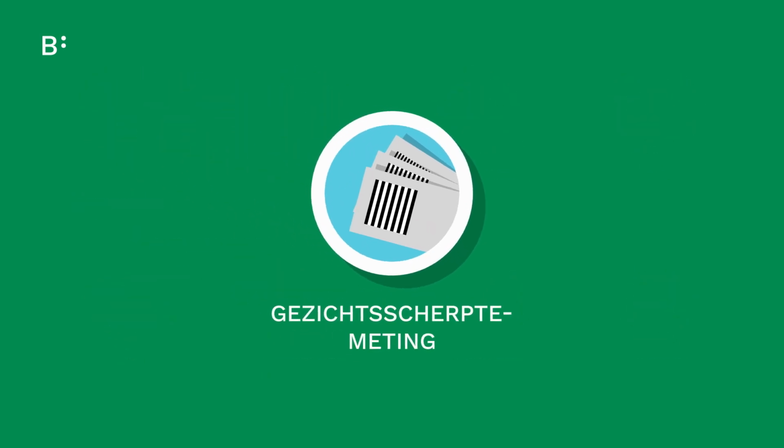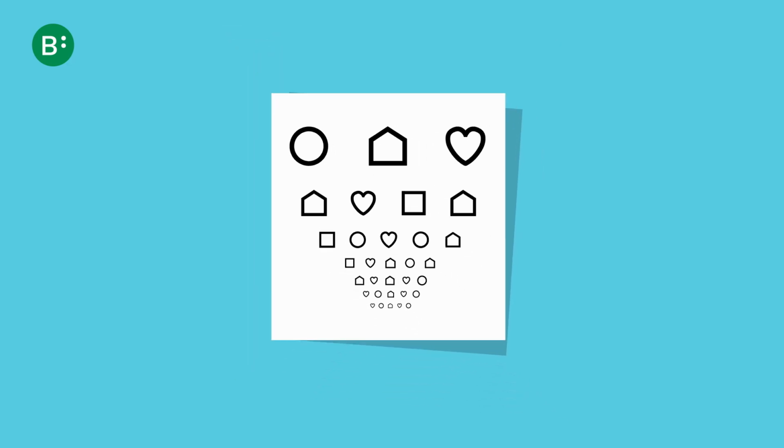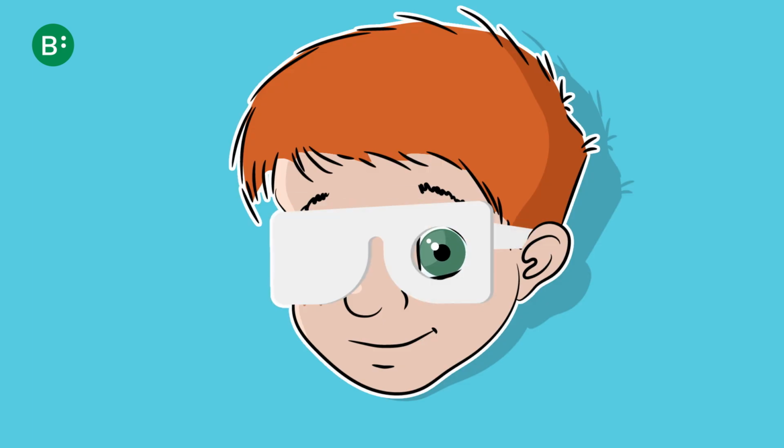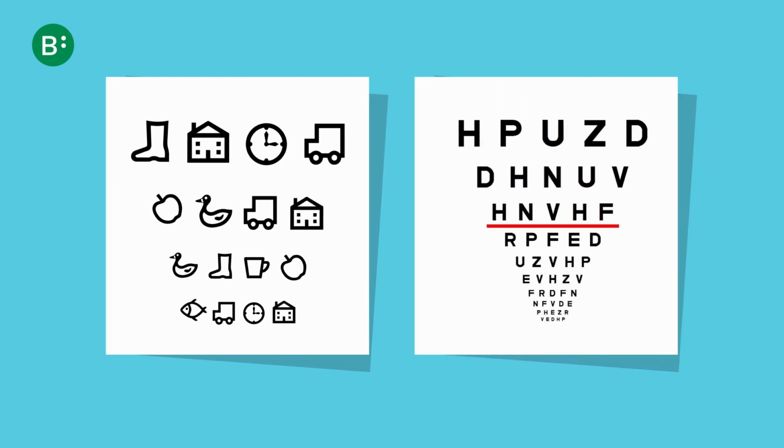Visual acuity test. We measure the details your child is able to see, both nearby and from a distance. The eyes will be assessed separately and together. The test includes pictures for preliterate young children and letters and numbers for children who can name them.